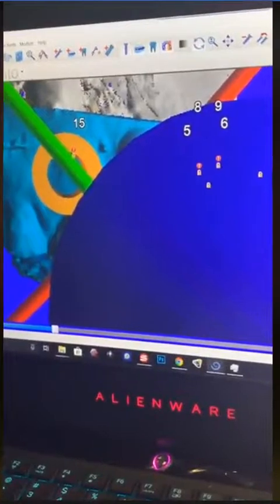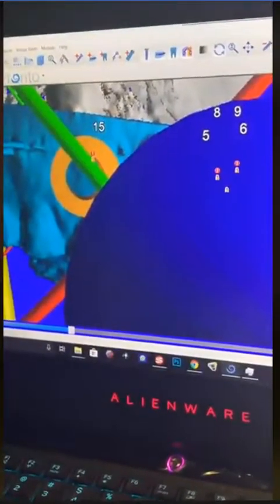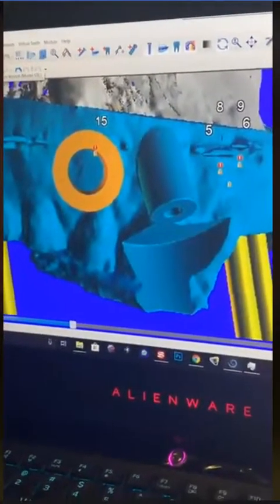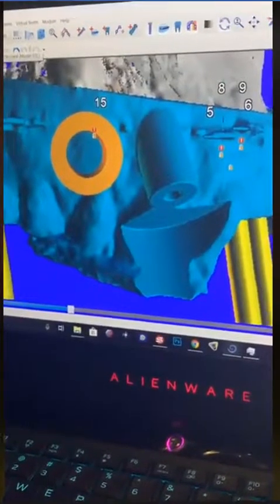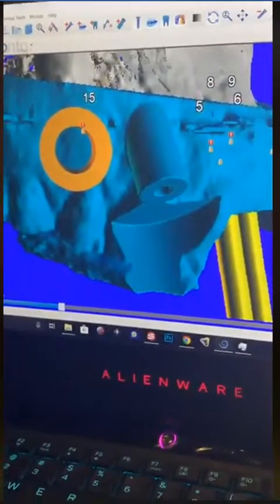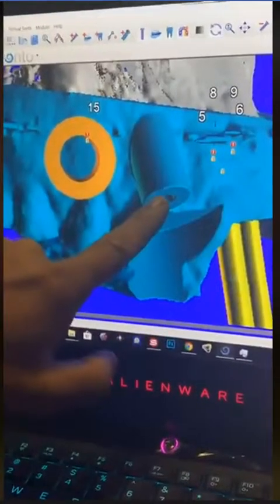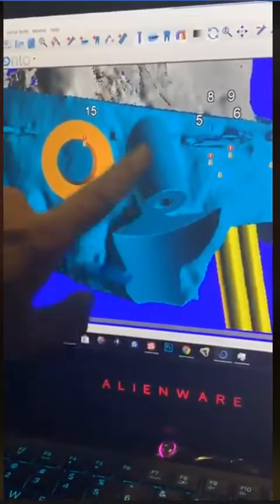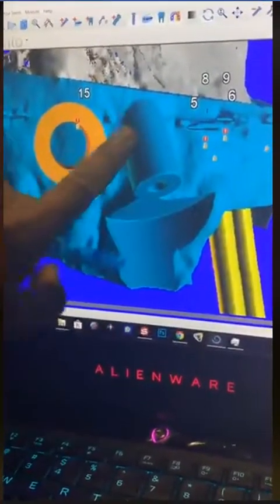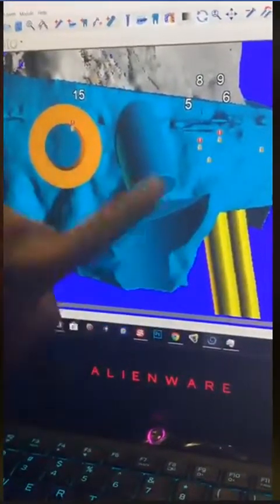And what it does basically is, I'm not gonna go with my mouse because it's gonna do that. What it does is, the Blue Sky Bio, you could buy a metal tube that gets inserted into this, and you could go ahead and do the surgery with. And now you have to have, then there is another moving part that you need to worry about. In this particular case, I don't have a moving part. It's all acrylic. There's nothing moving. It's in there, and you go ahead and put your burr through and you do the surgery.